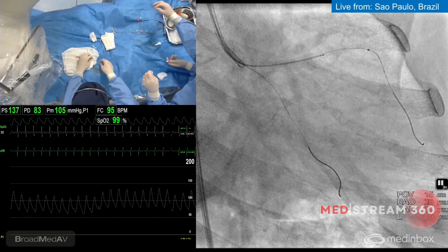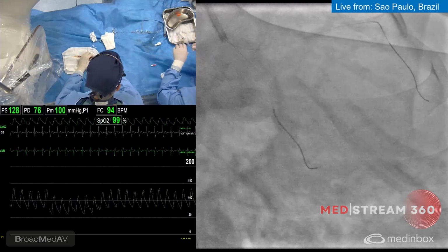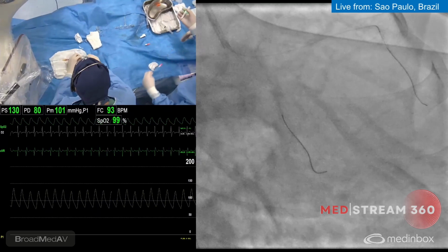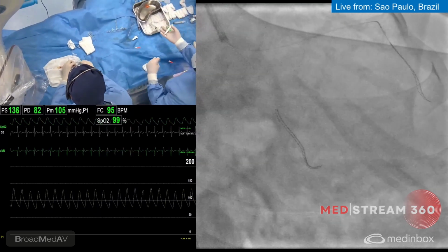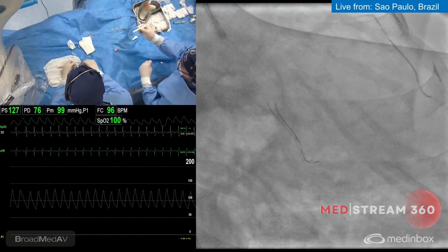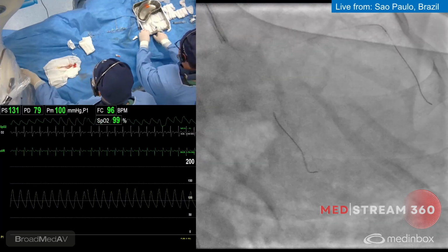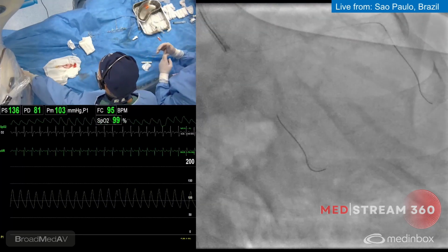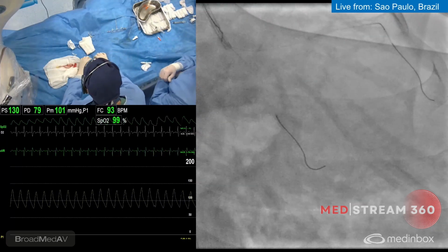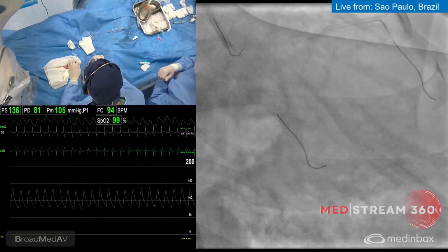Yeah. So I'm proceeding here with the wire. Okay. Now we're going to have the angio. Ricardo has advanced the system there. We have two wires, one in the LAD and one in the circ. Are you going to keep both over there? Yeah, you can keep the wire in the circumflex, but I'm going to remove the wire in the LAD. Maybe you can just keep the wire in the LAD because it's going to be easier for you to cross. And bring the wire back after you have the FFR wire in there.